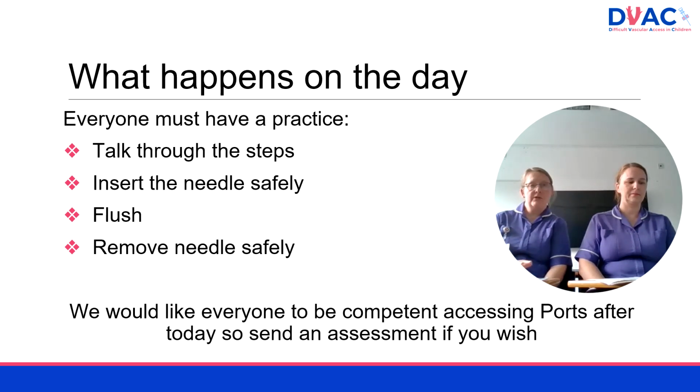So what happens on the day when you come to join us? Everyone will have a practice of accessing a Portacath on a dummy chest. So we will talk through the steps as a quick reminder. You will have a go of inserting the needle safely. You will flush the needle and you will then remove the needle. We would like everyone to be competent in accessing their Portacaths, so please send any assessments or bring any assessments with you that you need to be signed off with.